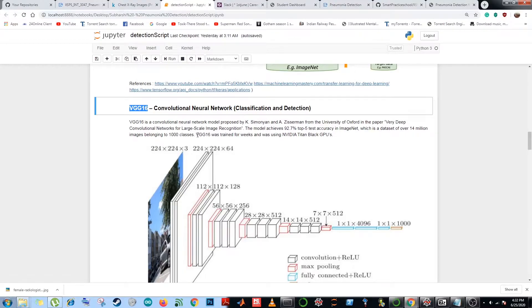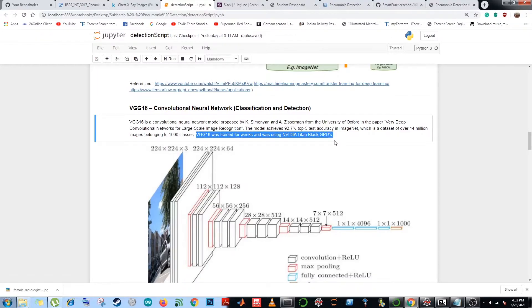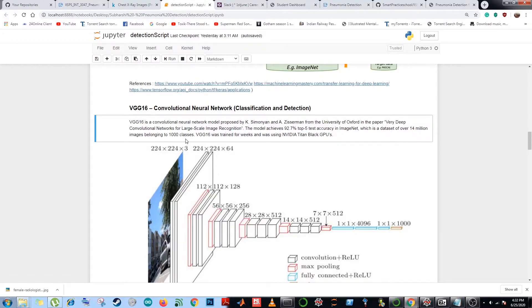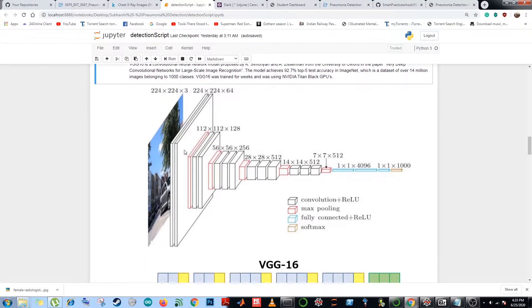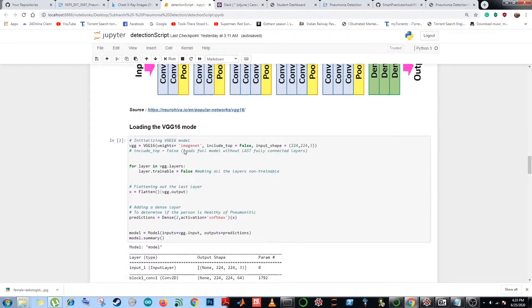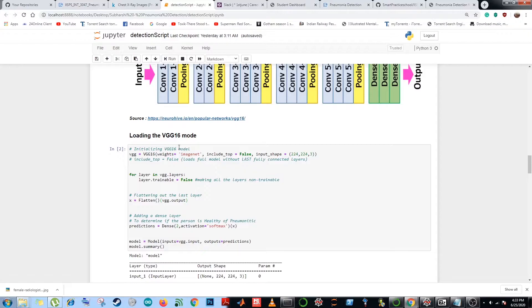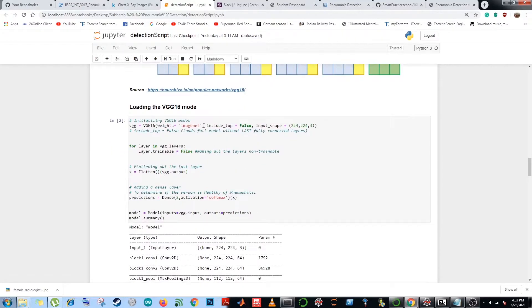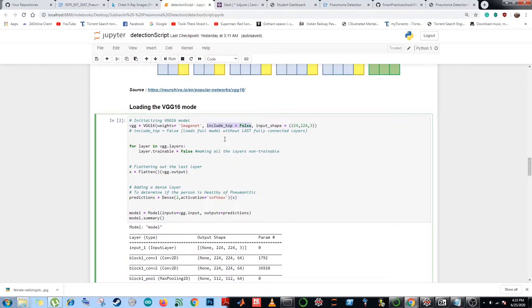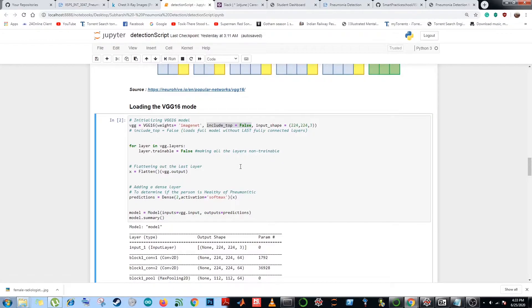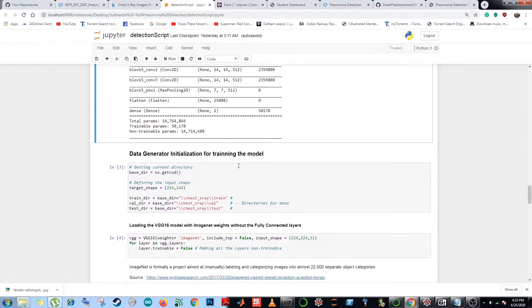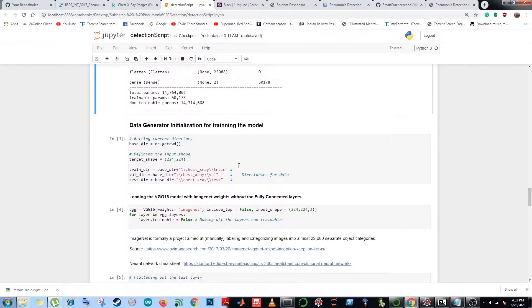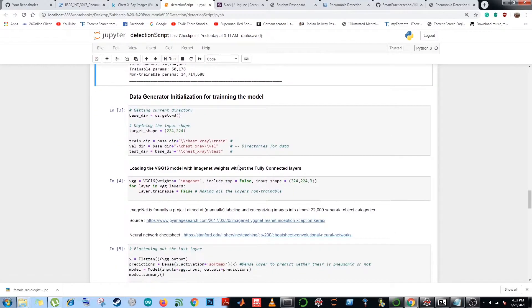The VGG16 was trained for weeks and was using NVIDIA Titan Black GPUs, which consists as a dataset over 14 million images belonging to a thousand classes. Over here, we have loaded the VGG16 model using the Keras applications module. This parameter is used to load the entire model except for the last fully connected layers. Also, we flatten the output of the model and add a dense layer to predict whether the person is healthy or is pneumonic.